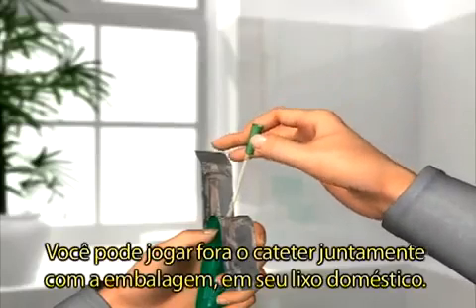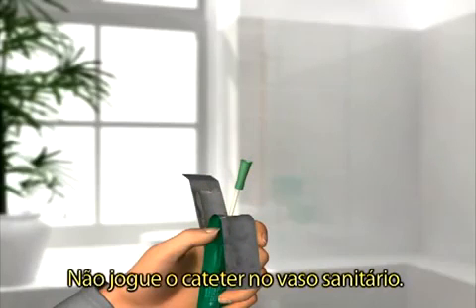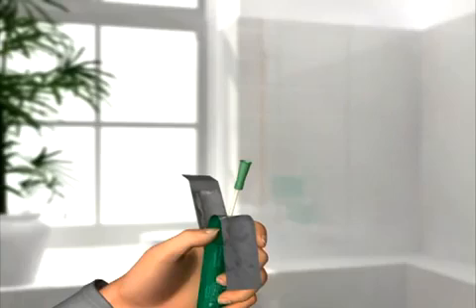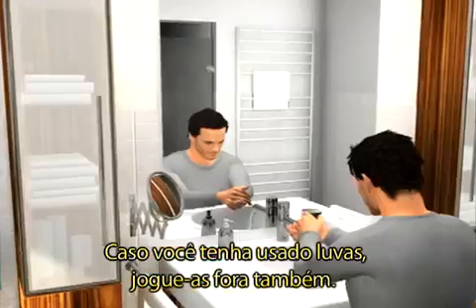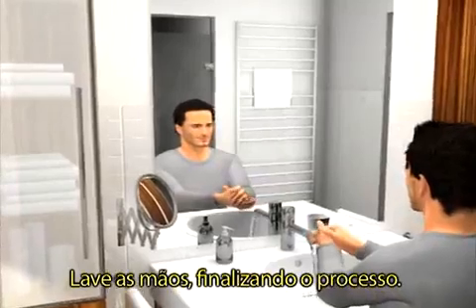You can dispose of your catheter and the packaging in your household rubbish. Do not flush it down the toilet. If you have used gloves, throw these away as well. Wash your hands, and you have completed the process.